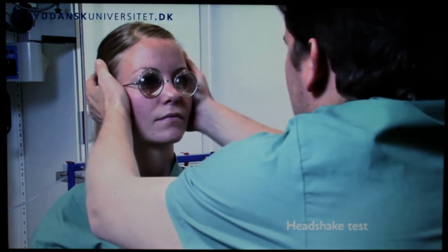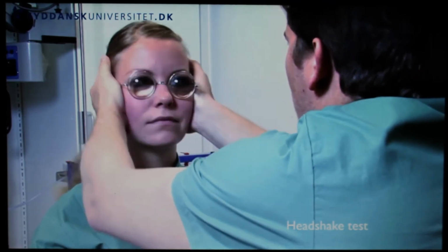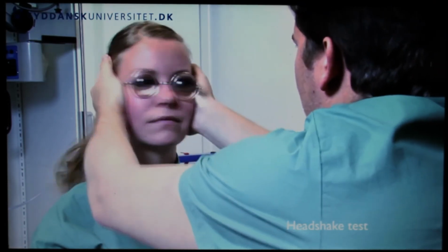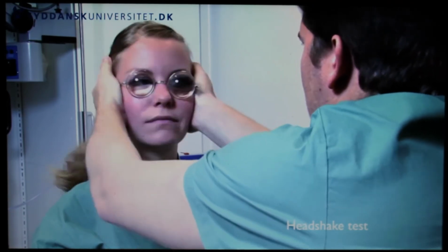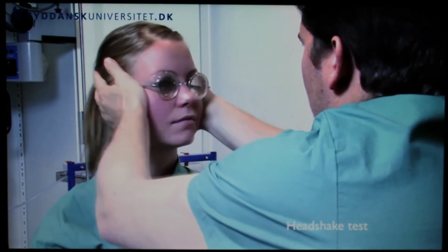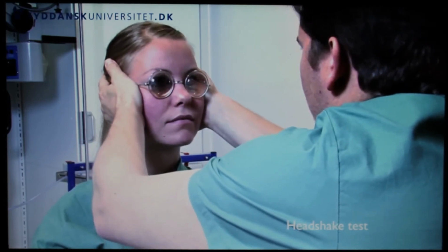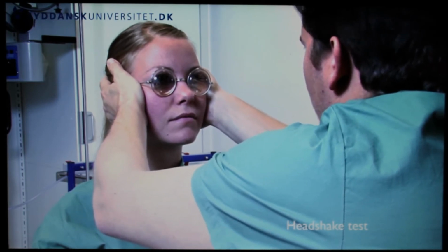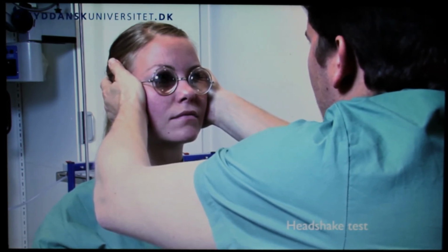I grab the patient's head and turn the head at a frequency of 2 Hz for 15 seconds. The patient shall wear Bartels' glasses or Frenzel's glasses or similar. After 15 seconds, I'll ask the patient to look towards me through the glasses, and then I'll watch for possible nystagmus beats. If there are more than 4 beats, the test is positive and indicative of pathology in the vestibular pathways, either in the ear, vestibular nerve, or brainstem.